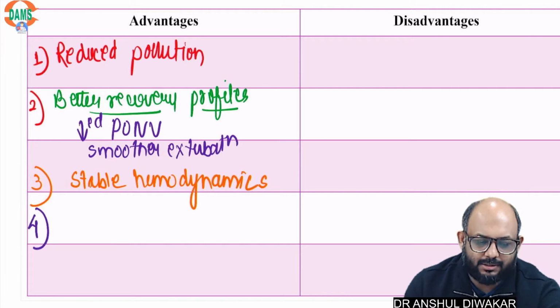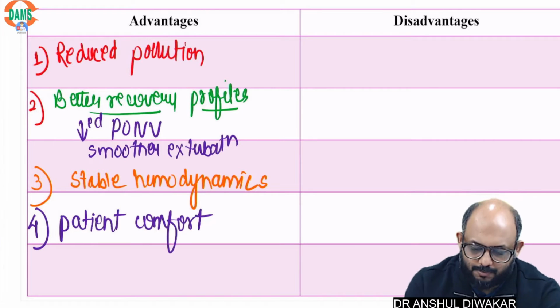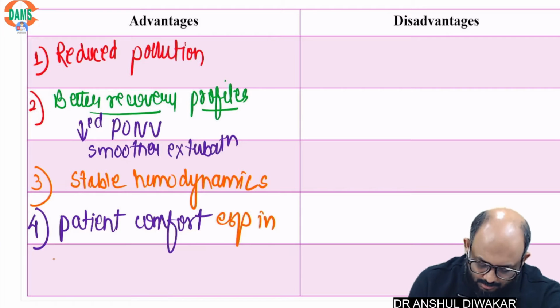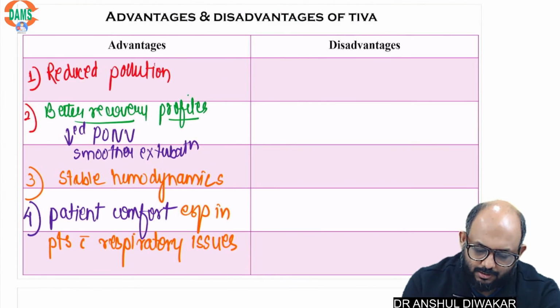Then patient comfort, especially in patients with respiratory complaints, where you have some respiratory issues, the use of TIVA is desirable.